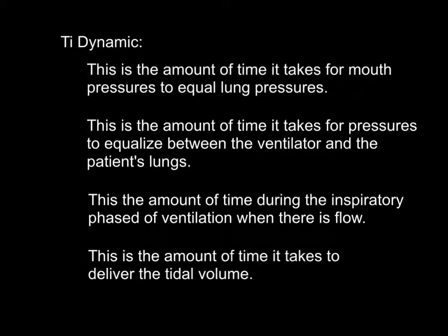So here I'm going to describe for you in words what our TI dynamic is. It's the relationship or the duration of time it takes for mouth pressures to equal lung pressures. Another way to state that would be the time it takes to equalize the ventilator pressures and the pressure in the patient's lungs. It's the amount of time that there's flow occurring between the patient circuit and the lungs. So the amount of time during the inspiratory phase of ventilation when there's flow. It's the amount of time it takes to deliver the tidal volume.